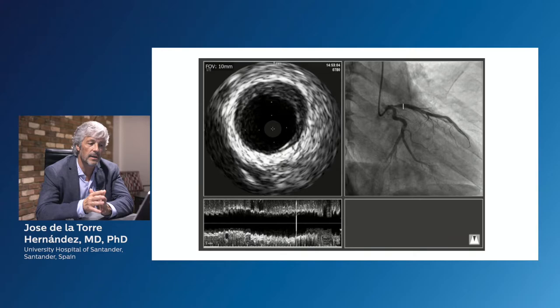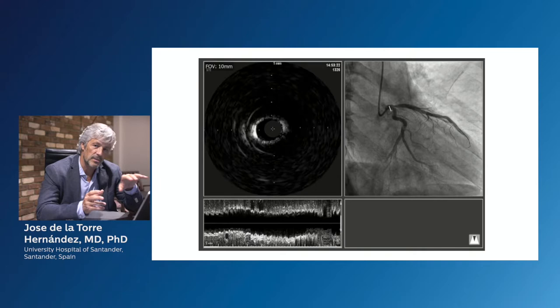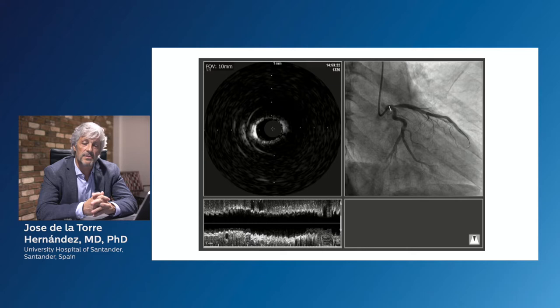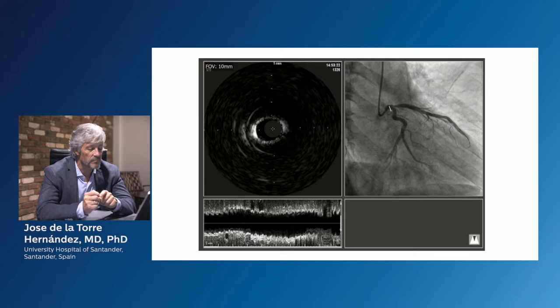And you see in the ostium, we can see a huge amount of plaque and how this plaque is extending to the left main. It's very clear that almost always ostial lesions in the LAD are coming from plaques that are also in the left main.